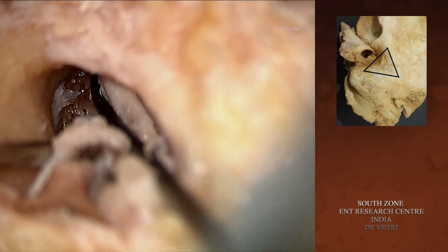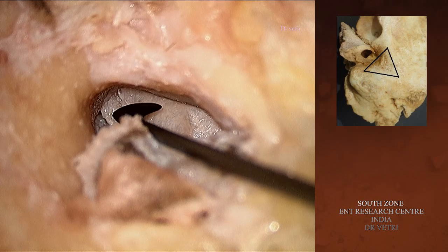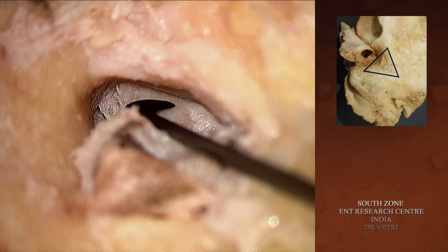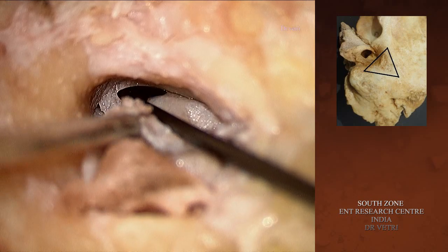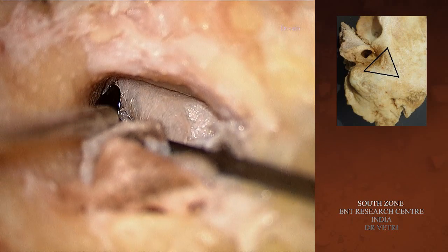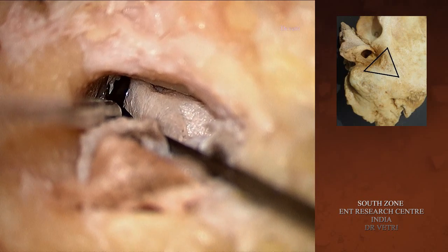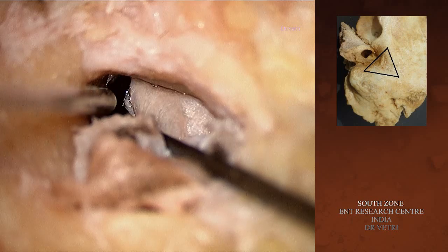You can see the small mucosal tags. See how beautifully the canal wall skin is elevated.